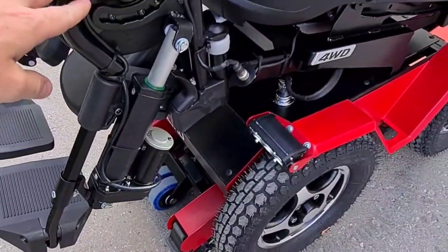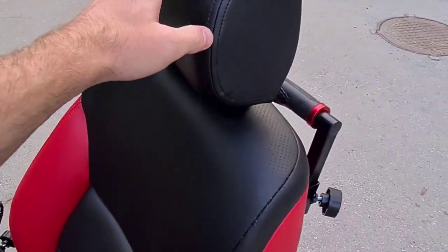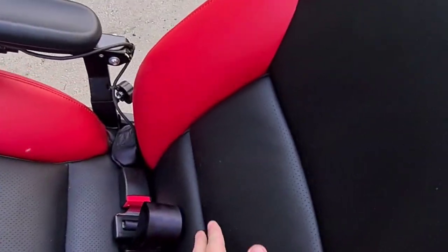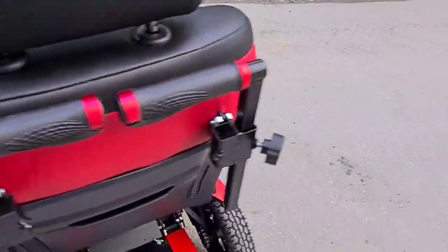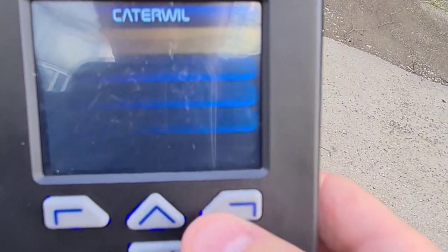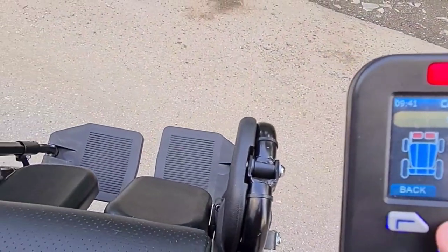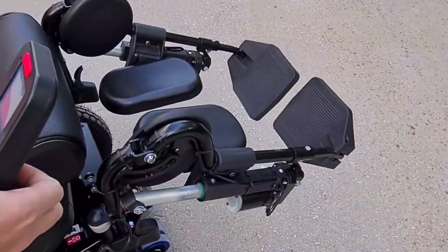With electric legrest, electric backrest, headrest, electric length of the cushion, back support — two axes of back support. Also the upper side of the seat is also adjustable. This is how it works: you go to menu, you go to chair functions, and yeah, footrests. This is how they go together.